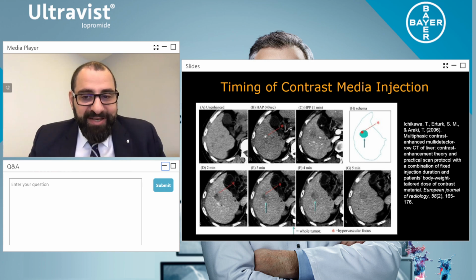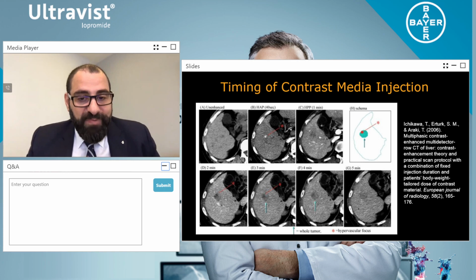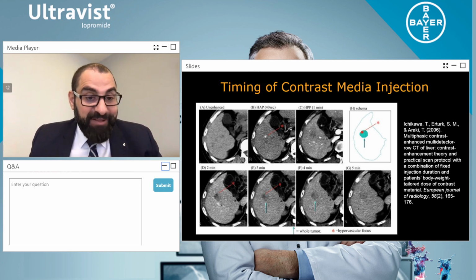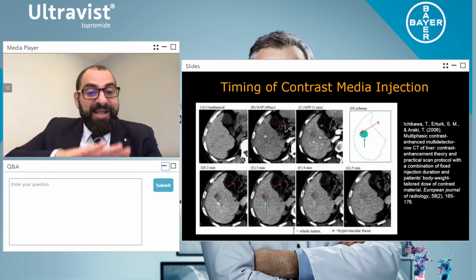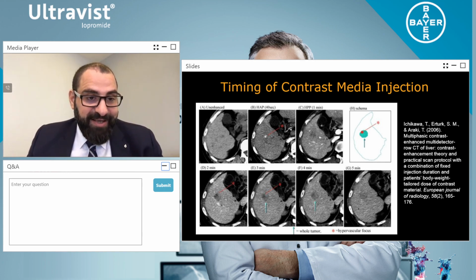What's really important here is that, and this paper was actually published in 2006, by the way, with low, the whole tumor actually looks better and larger, okay, when you have your delayed phase, because it's not the lesion that's enhancing, it's the parenchyma that's enhancing perfectly. And more importantly, this was not done at 100 kVp, it was done at 120. So the importance of having a longer delay time is important.